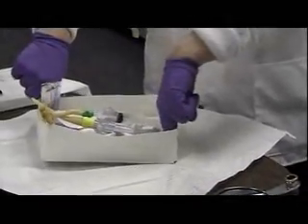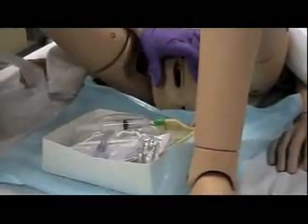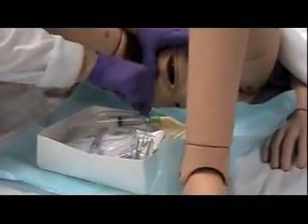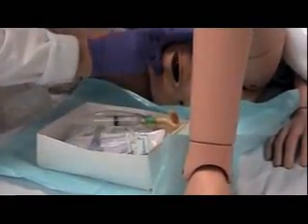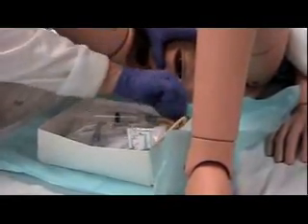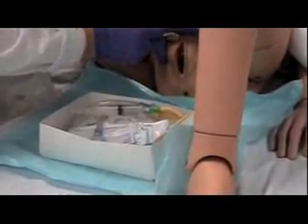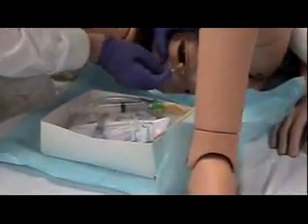Now I am ready to move the catheter kit over to the bed, picking it up on the inside. Mary, I am going to be touching you now and it is going to feel cold because I will be washing you off. With your betadine swab, you go down one side, then the closest side, then over the urethral opening — one swab per stroke.